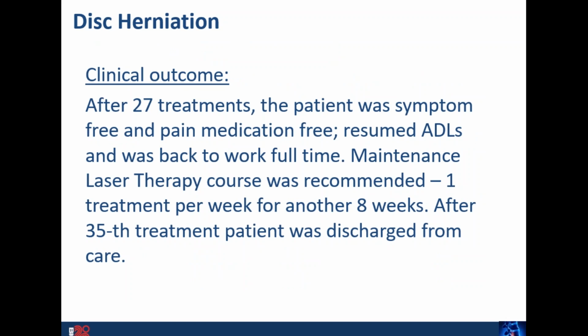The clinical outcome, again, it took about 27 treatments, which again, when you're dealing with a moderately severe disc herniation, that's to be expected. The patient was able to resume his normal activities of daily living, back to work and so forth, and it was about 35 treatments in total, including the once-a-week maintenance program before he was discharged.